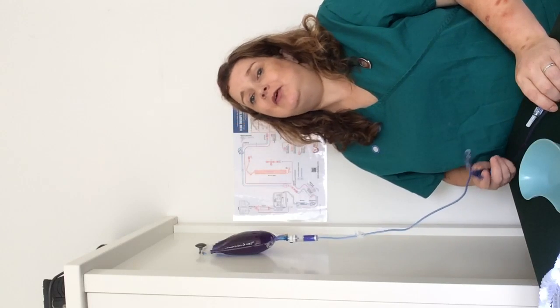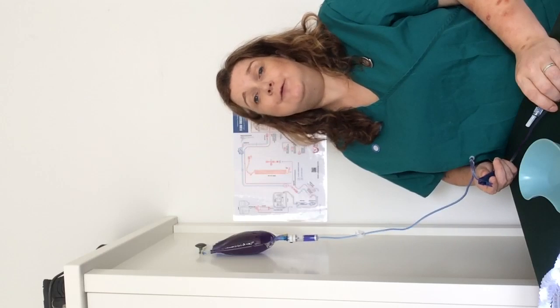Hi, it's Jane RBN back with some more OSCE tips. This time it's just finishing off running through your fluids and what to do if you've got a bubble.